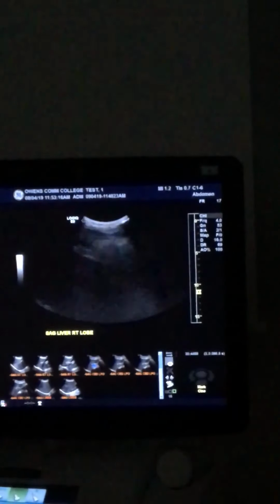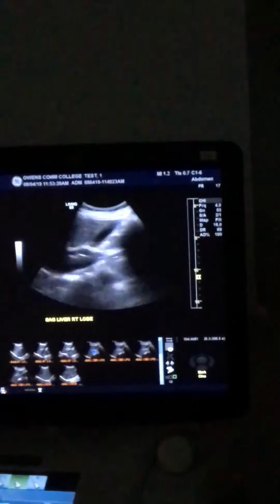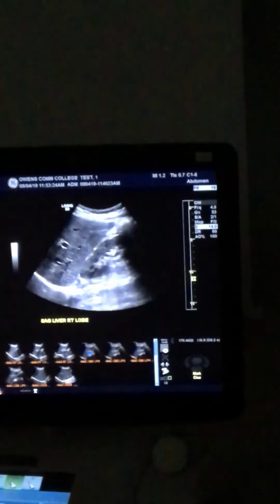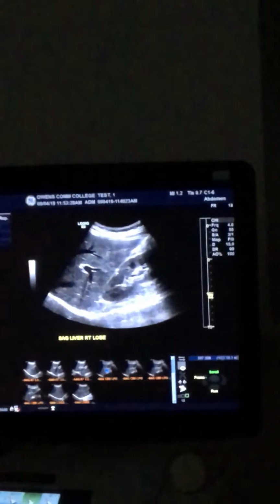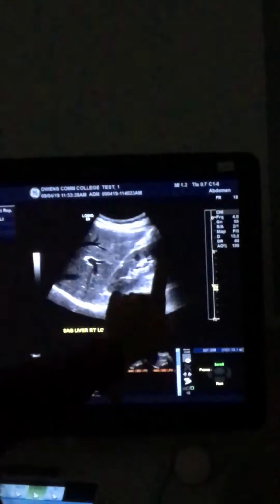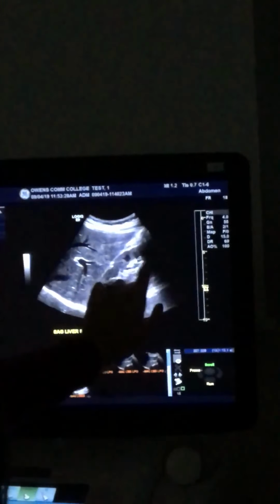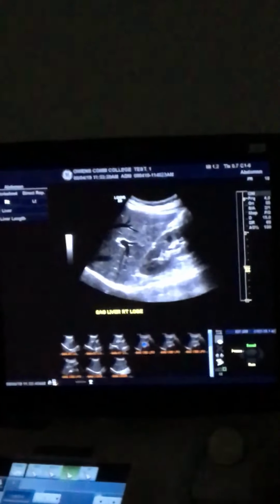And then I'm going to look at her liver kidney interface. Go ahead and take a deep breath in and hold. A lot of times, if the kidney is kind of gassed out like it is right there, I will roll them up. I'm not going to make her roll again because that's mean. Go ahead and breathe. But obviously, you can't really rule out that there's anything on this inferior pole. So ideally, you would roll her up so that you can see it. And usually, that does the trick to get rid of the bowel gas. If not, you may have to come through the ribs.